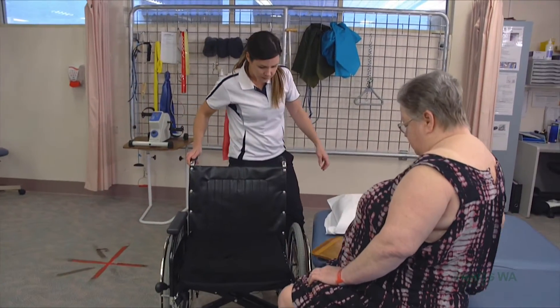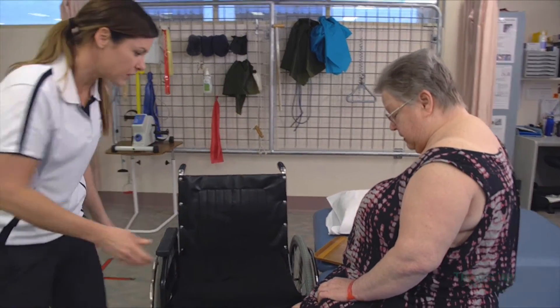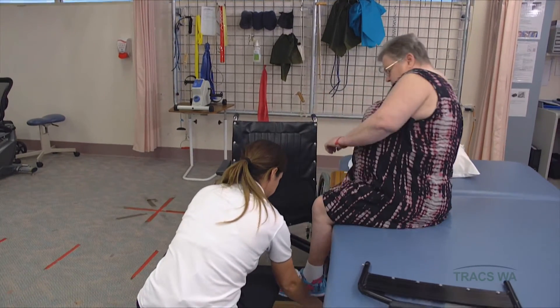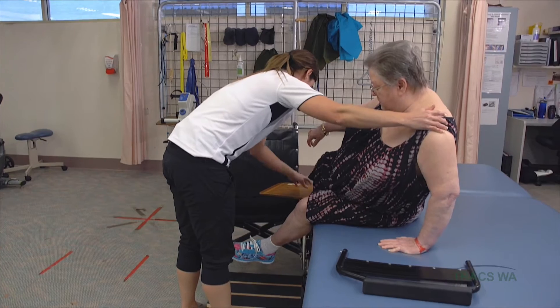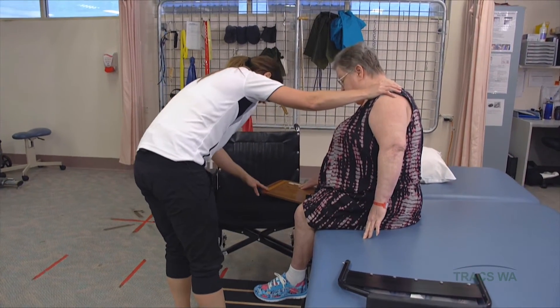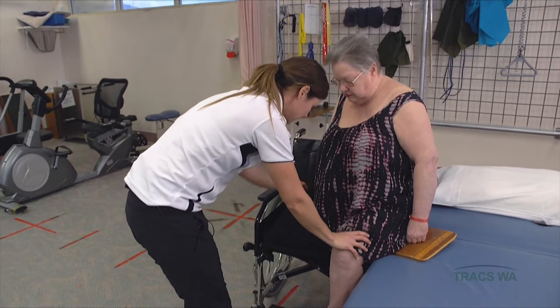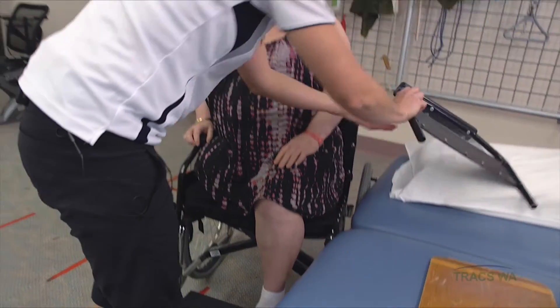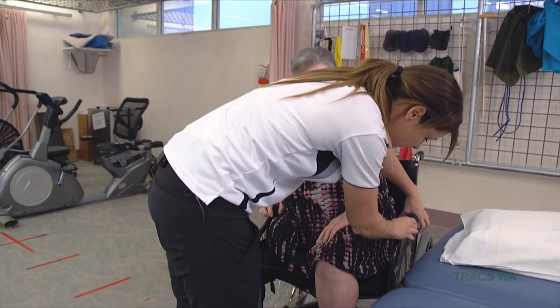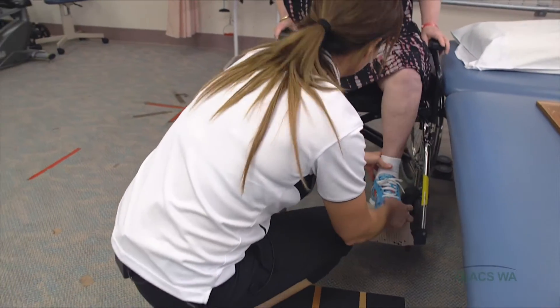Let's put this bed a little bit higher to make it a bit easier. Can you just shuffle a bit closer to the door? We'll lean over towards your left side and pop that underneath your leg — that just goes over the wheel and closes the gap. We're going to do the same thing again, just take your time. Get this leg nicely on the box and scoot your bottom across, trunk forward, bring your hand across, and lean over and I'll take that one away. Well done. We'll pop your armrest back in, take that block away, and give you back your footrest.